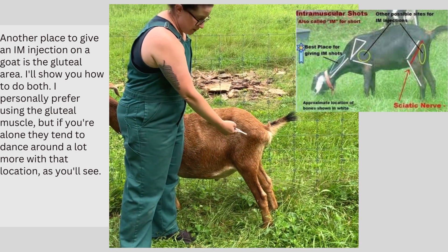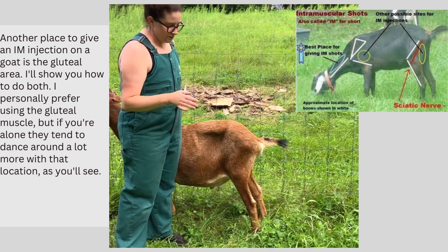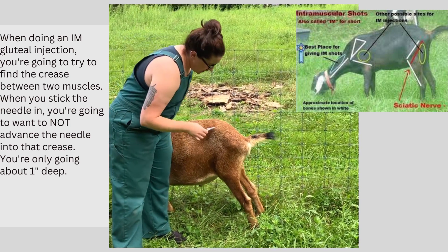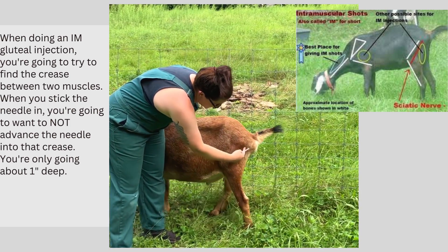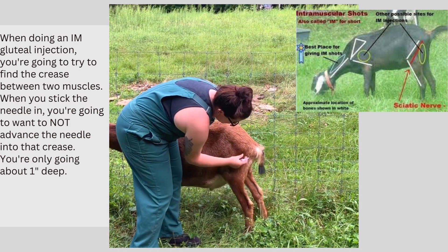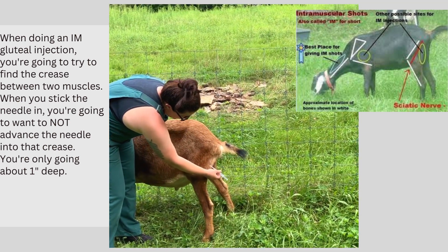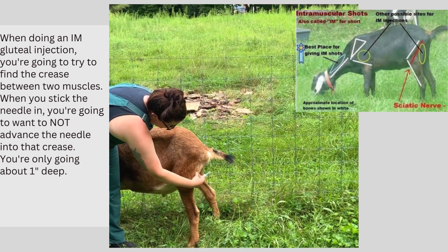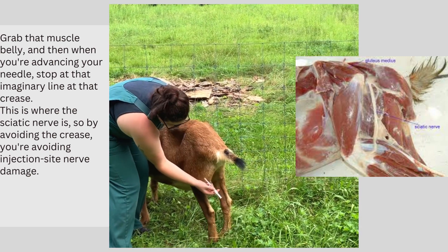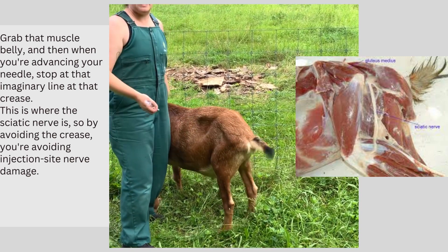I personally prefer using the gluteal muscle, but if you're alone, they tend to dance around a little bit more. When doing a gluteal intramuscular injection, what you're going to try to find is there's typically a little crease right here between this muscle and this muscle. When you stick your needle in, you're going to not advance into that crease — you're only going this far in. You're going to grab that muscle belly, and when you advance your needle, you're going to stop at your imaginary little line up that crease there. That's your anatomy landmark for that.